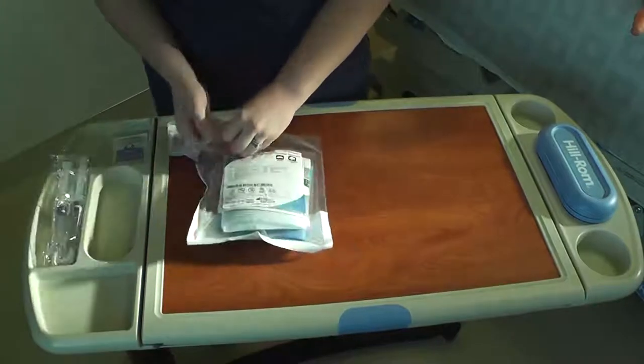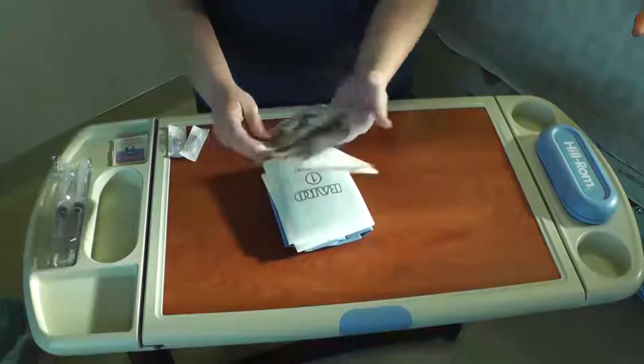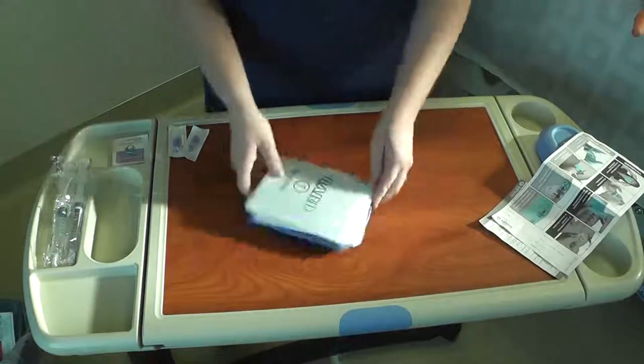Open the dressing system, which contains visual instructions. You'll notice there are two bundles: Step 1 and Step 2.